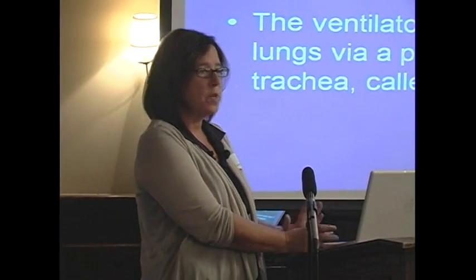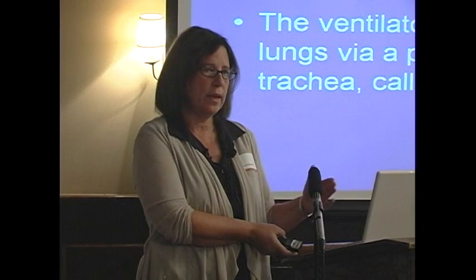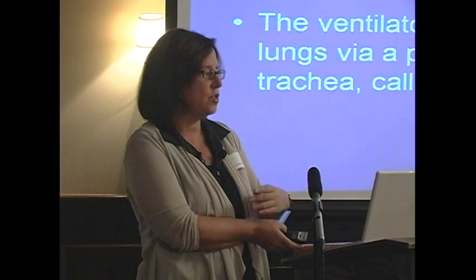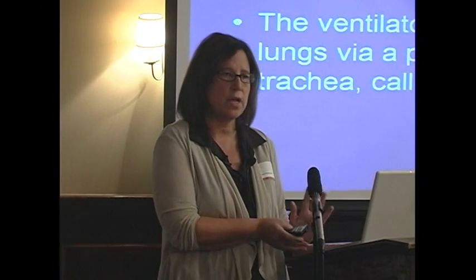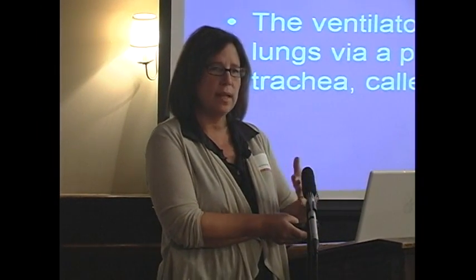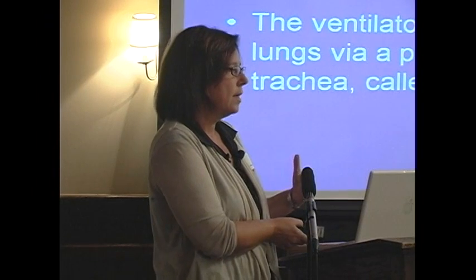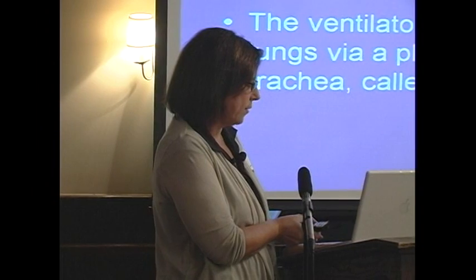And most people, not everybody, but most people who require a ventilator for respiratory support are usually on it 24 hours a day. Now again, that's not always the case. There is the occasional person who requires a ventilator and may be able to be off it for some time during the day. But I would say that the majority of people who reach the level of respiratory muscle weakness that they require a tracheostomy and a ventilator are using it 24 hours a day.